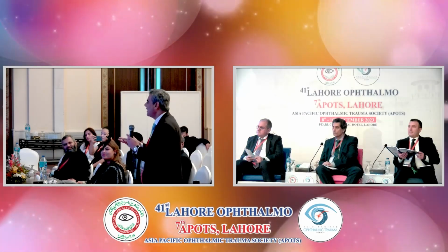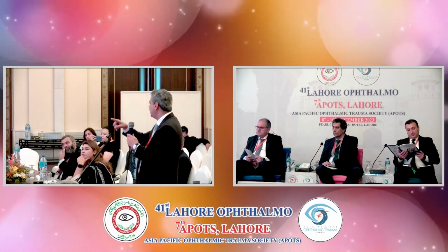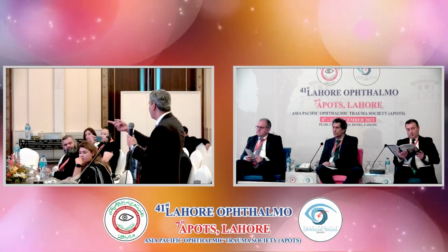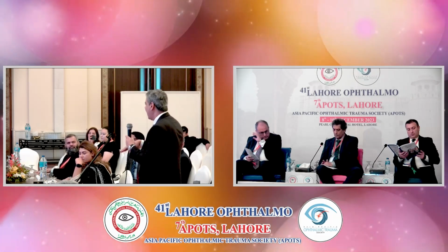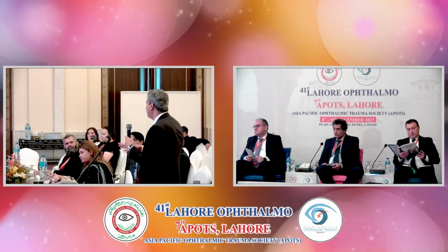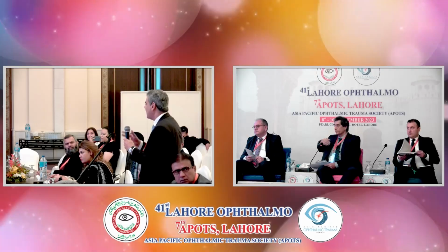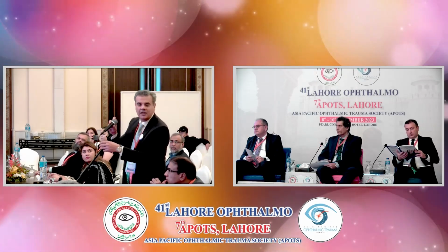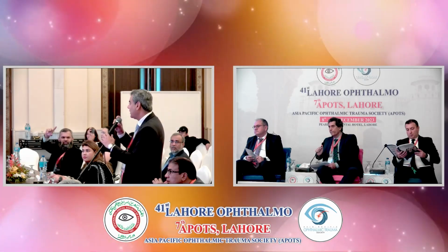So this is the new concept that we started in 2019 with this technique of grafting the macular hole. And this is the same concept that people are using in temporal flaps and everything. Stuffing any macular hole, primary or secondary, I think is not the technique for any visual improvement and not a future technique for anything. That was just my humble opinion.